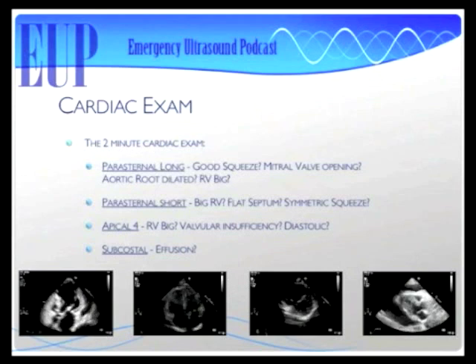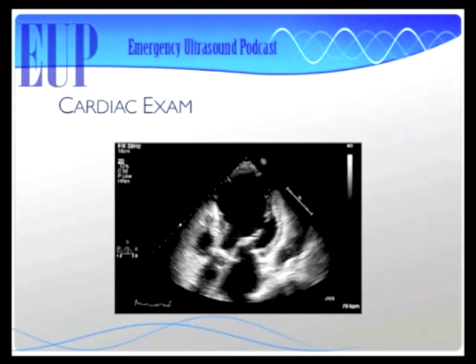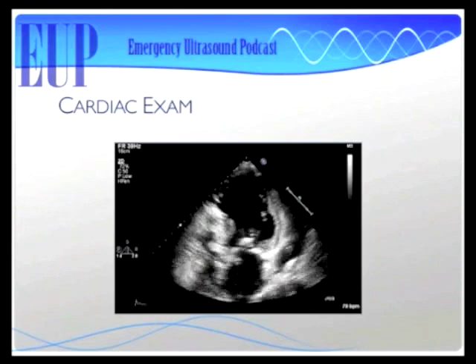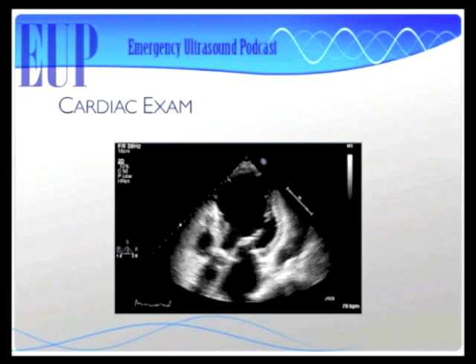So this is an example of an augmented apical four-chamber view, Matt. Do you see anything abnormal in this heart? Not really. Exactly. So the ejection fraction is extremely reduced. It's got apical akinesis, so somebody's probably had a pretty big LAD lesion.